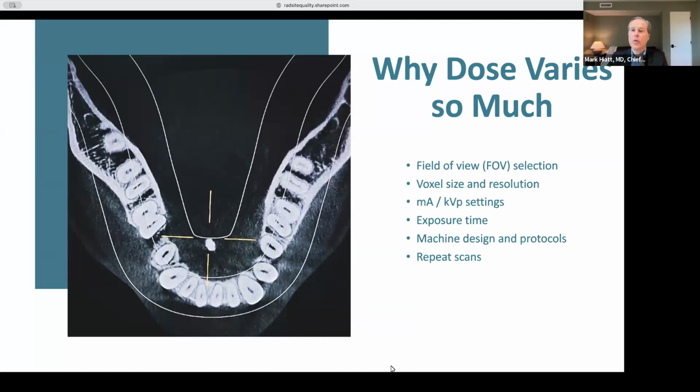I see. So when you have that option, though, as a patient, when there is a shield available, should you request it regardless of the modality? As practical advice to patients. That's pretty much what we recommend to all the imaging centers and hospitals. As Chris rightly put, we're in an environment where people are taking either side right now. As a physicist, yes, I know that the dose is not going to be as high, but I also come from a background of saying any little radiation is going to be harmful.